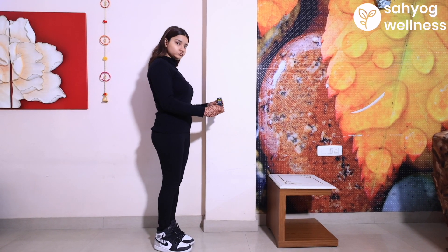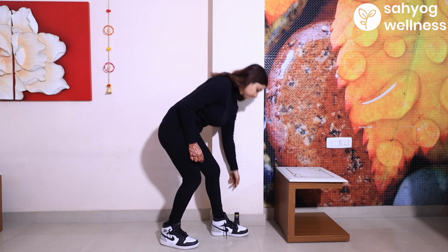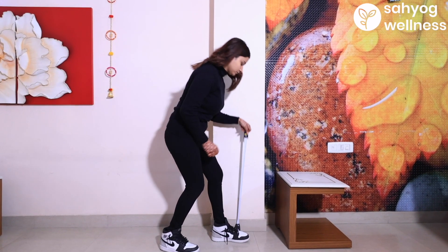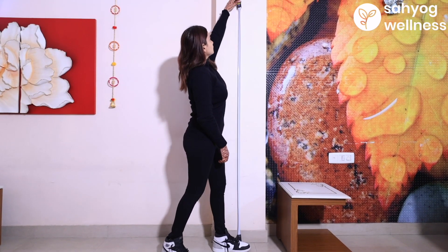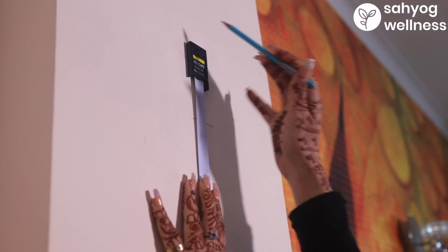To get started, put the stature meter at the bottom of the wall. Hold one corner with your foot and pull it up till 200 centimeters until it shows zero as a reading. Then fix it with the help of tape tentatively.